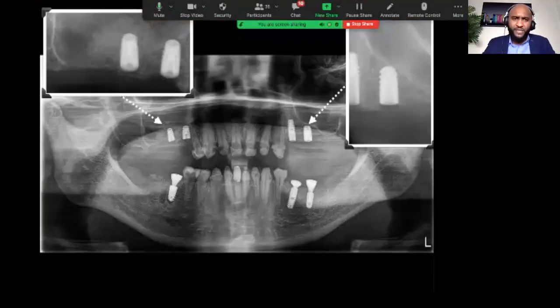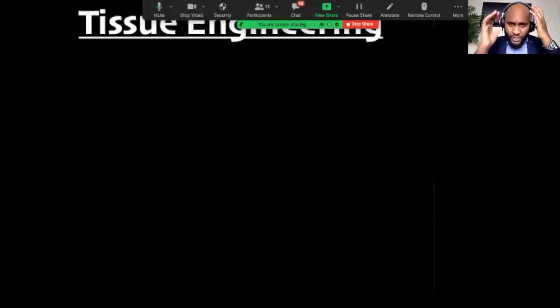So that's the case with the sinus elevated and material filled. This case is now about 5 months, so I have about a month and a half or so. Then we will do exposure of the upper jaw. And I'll be happy to share with you the same case at some time when UDA invites me again.